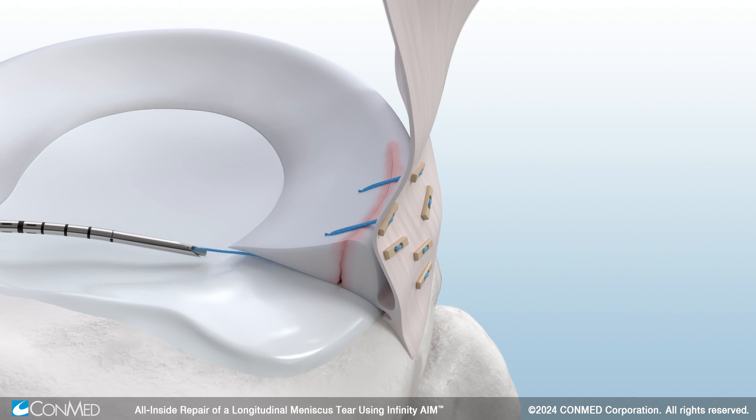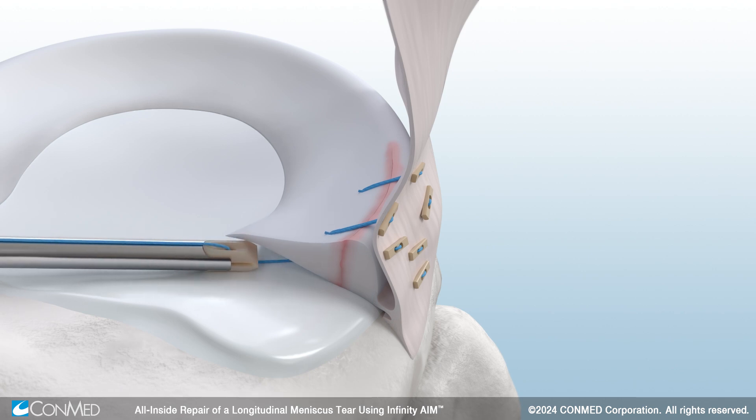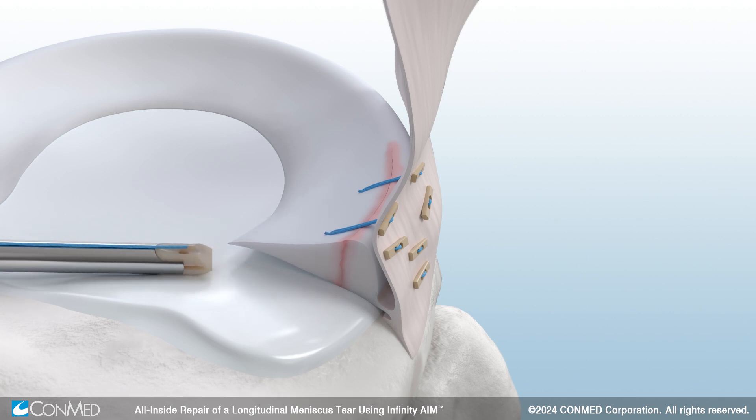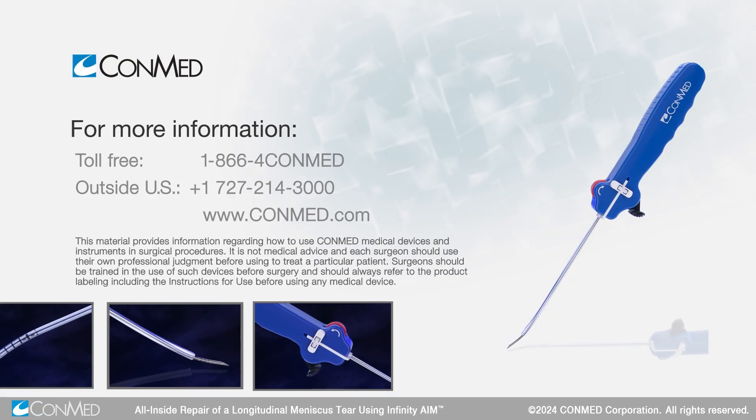Close the superior gap by fully tensioning and cinching down the inferior implants, allowing for a top-to-bottom compression. Once the desired tension has been achieved, cut the suture to complete your repair.